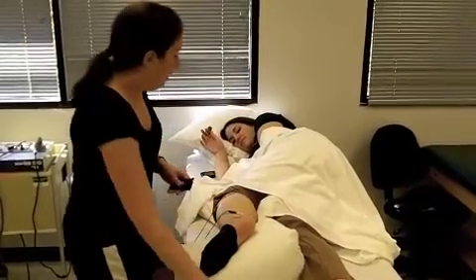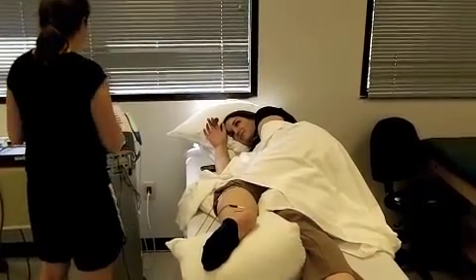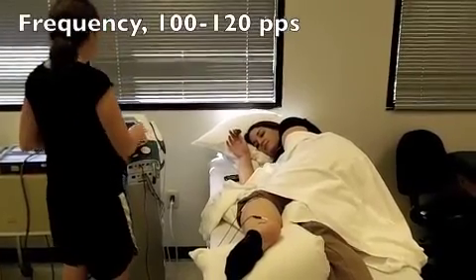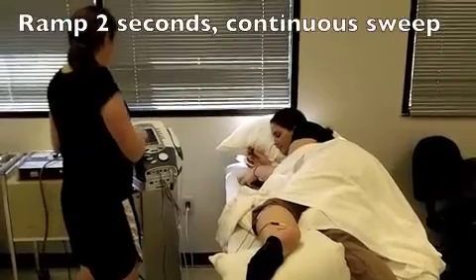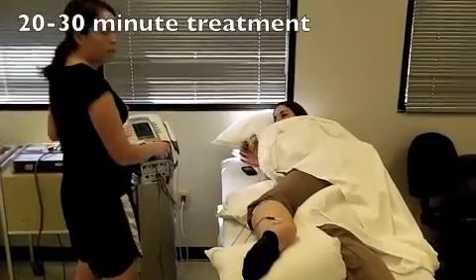Once we have the pads on, we're going to go into e-stem — we're going to go high voltage. With high voltage, we're going to start off at 100. Make sure the polarity is negative. It's going to be ramped two seconds and it's going to be continuous sweep. We're going to do it for 20 minutes.